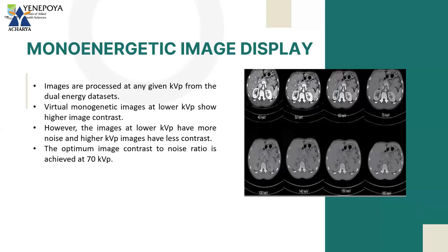One second. There are two questions. One is about VMI, and the other one is how DECT will impact angiography, as we are already using contrast media. I'll be answering both questions with the help of VMI itself, because that is the technique involved here. So I expect both of you to listen to this carefully.